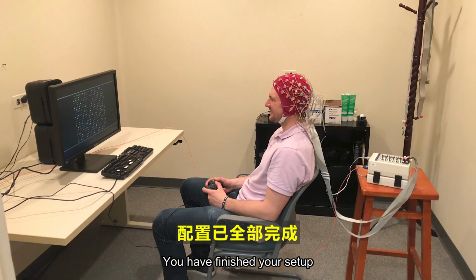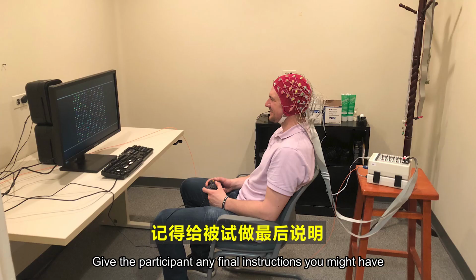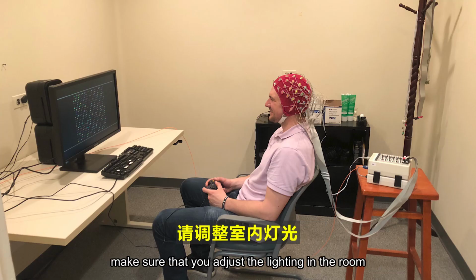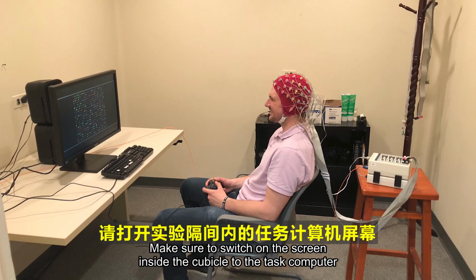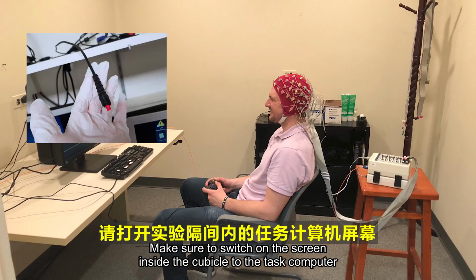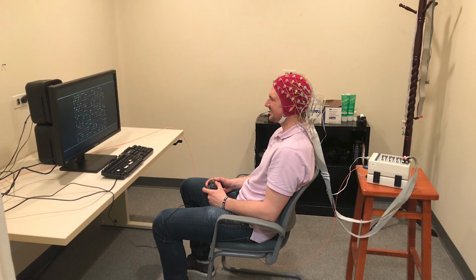Congratulations! You have finished your setup and are now ready to record your data. Give the participant any final instructions you might have. Make sure that you adjust the lighting in the room to the brightness that you have chosen for your testing and exit the room. Make sure to switch on the screen inside the cubicle to the task computer by using the small red button above your desk, and don't forget to start recording your data.